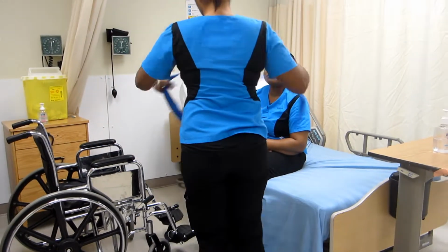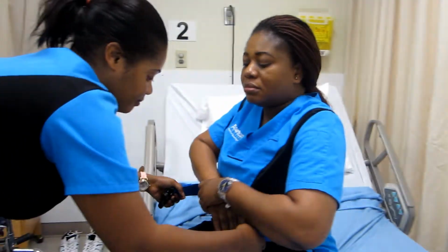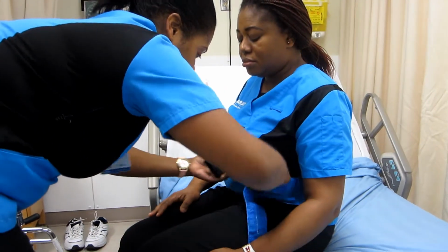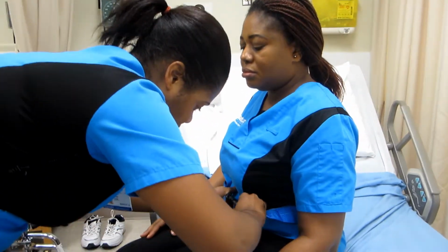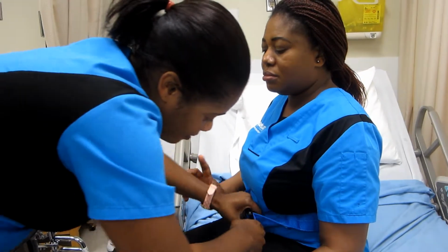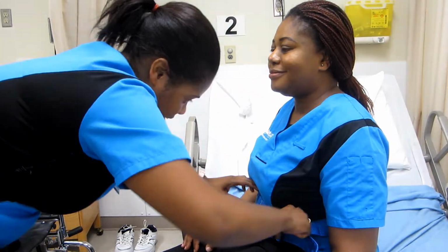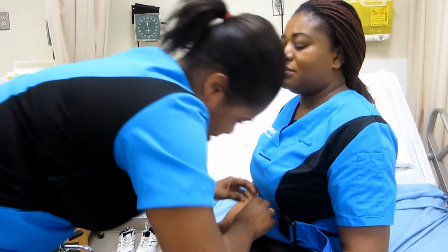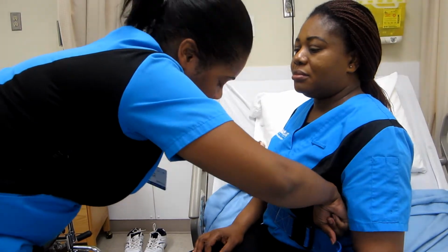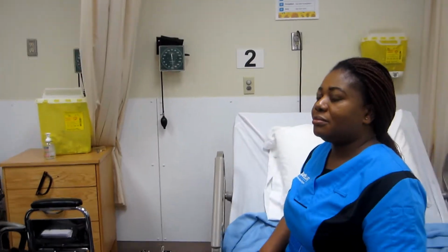And if it's okay with you, I'm just gonna put this transfer belt around you. Okay, I'm just gonna make sure that it's a little bit more, and okay, 2-finger fit. Okay, it is good. I'm gonna get your shoes ready.